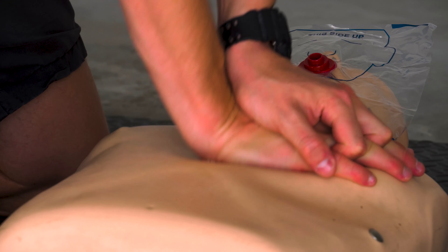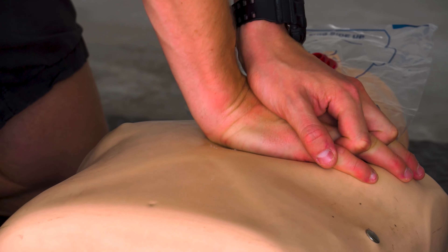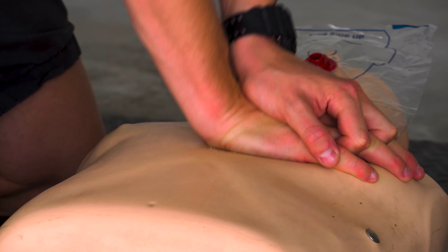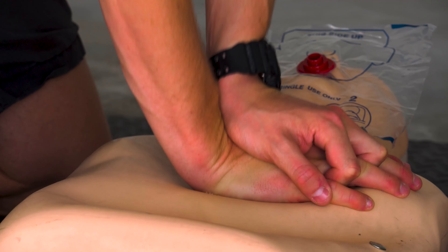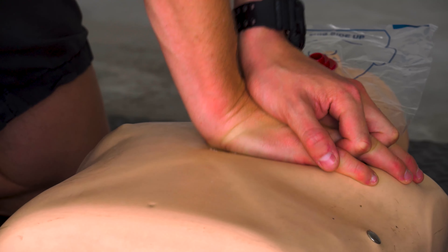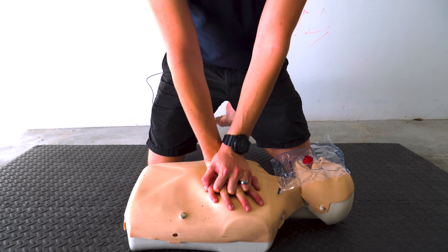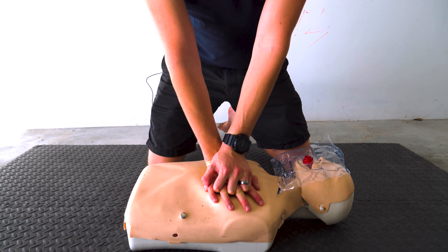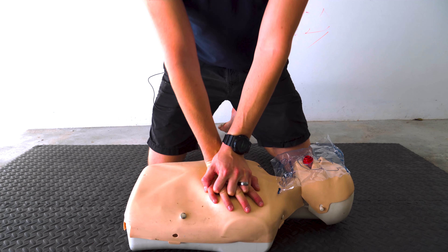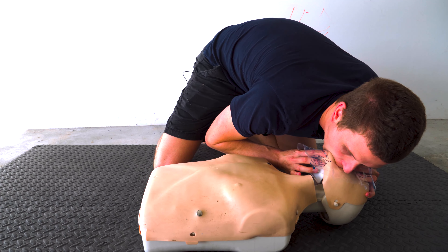Performing second set of 30 chest compressions, counting through to 30.